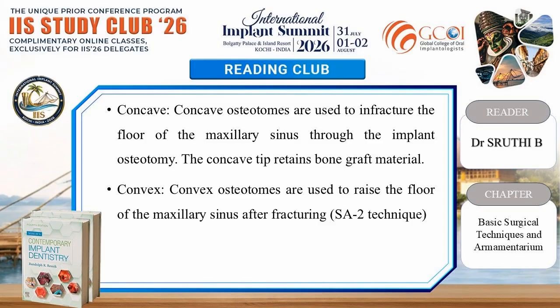Concave osteotomes are used to infracture the floor of maxillary sinus through the implant osteotomy. The concave tip retains bone graft material. Second one, convex. Convex osteotomes are used to raise the floor of the maxillary sinus after fracturing, that is SA2 technique.